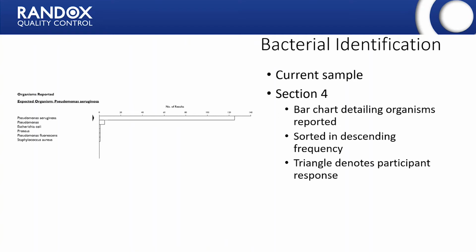So once again, the expected organism is recorded just above that chart, just to highlight what the correct organism was.